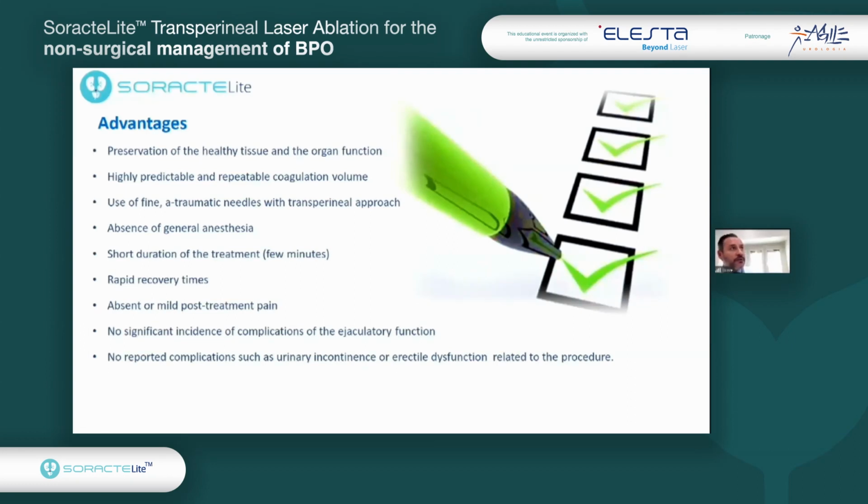You have to believe me. So the patient doesn't feel any pain. The only discomfort is the catheter, but it's a very tender Foley catheter. So basically, this doesn't give a lot of pain or discomfort to the patient. There's basically an absence of general anesthesia. So it's a kind of procedure that we can run on an outpatient basis.